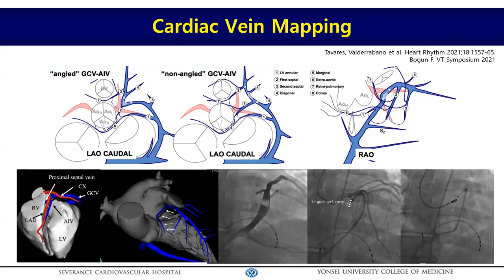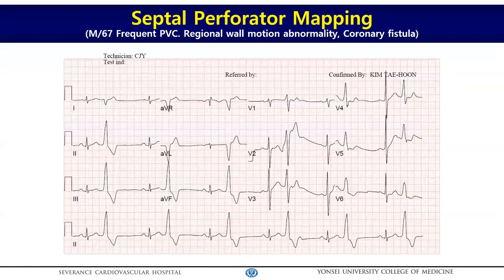A coronary vein map with a microcatheter provides a good landmark during ablation, estimating the location of coronary arteries. You can even use the coronary vein for alcohol ablation. So I recommend mapping the coronary vein for VT from the LV summit based on the anterolateral wall or crux areas.